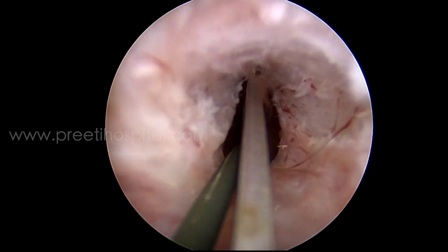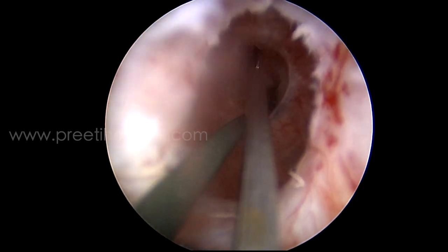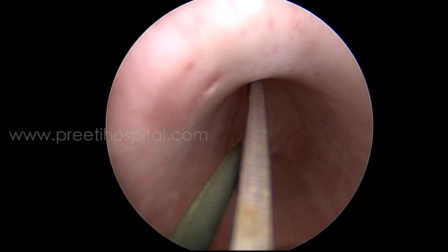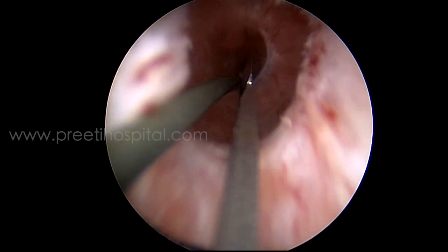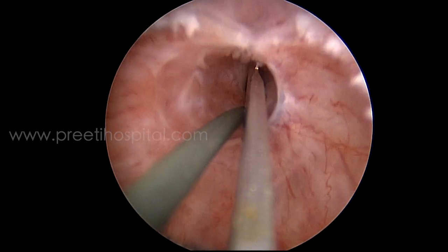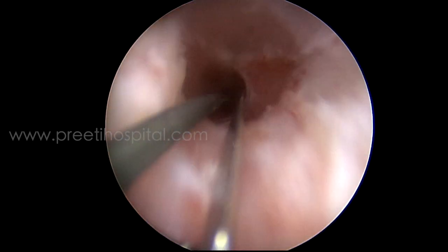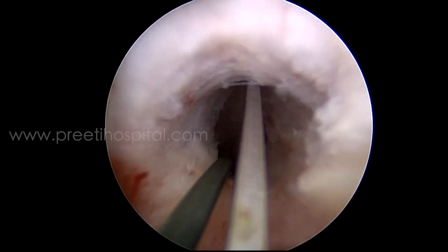As the surgery goes on, the guide wire goes into the bladder. I always feel that the distal part of the urethra has to be cut with a clean cut, so that your 21 French scope goes easily into the strictured area. Don't try to cut directly into the deeper areas first — cut the normal area first, make it more than 21 French, then your scope will go in cleanly.